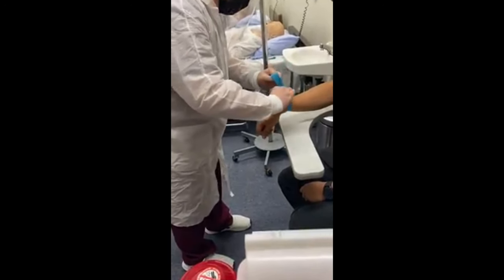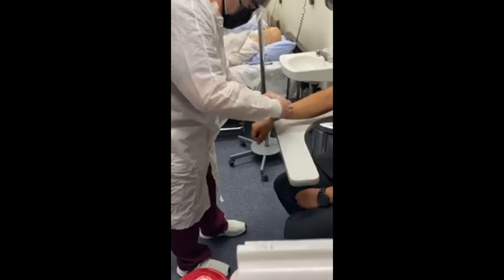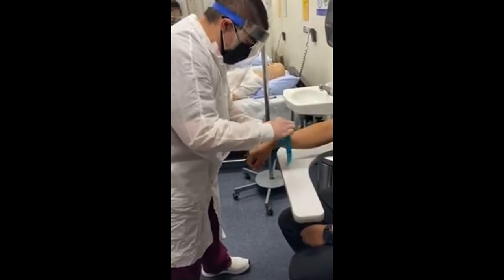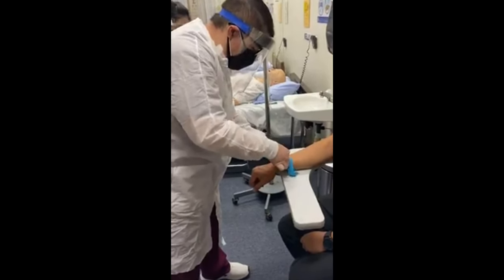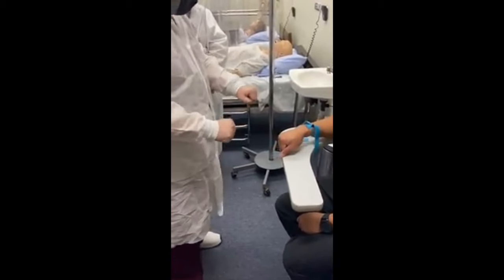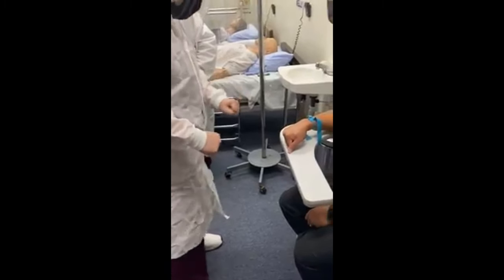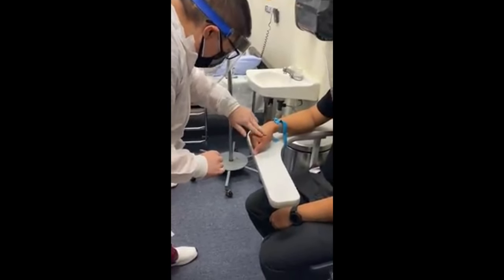Okay. Are you okay, sir? Good tension. I want to make sure you're good. And it's an option for you, if you want to decide whether to have me hold here like this, or can I have you just hold up this? Okay. Alright. So now we're going to look for your vein, okay?